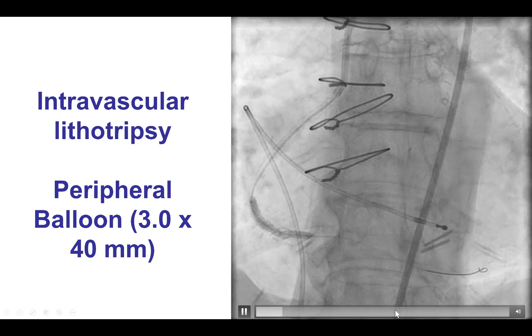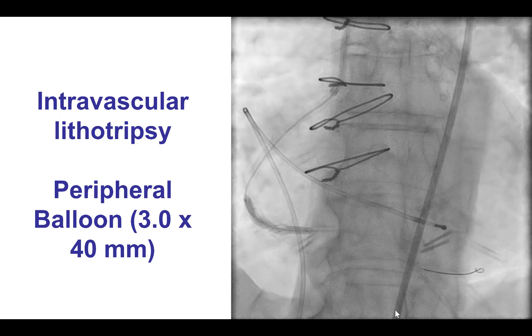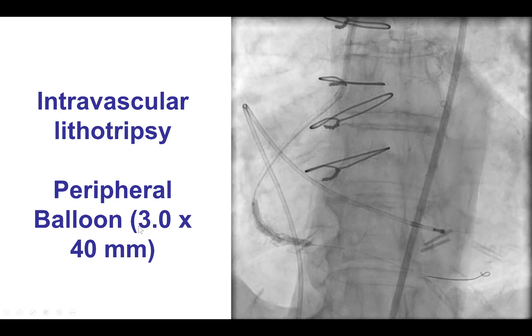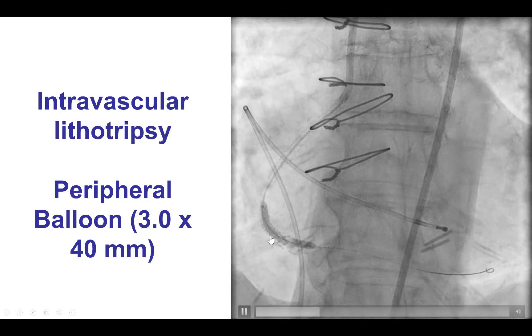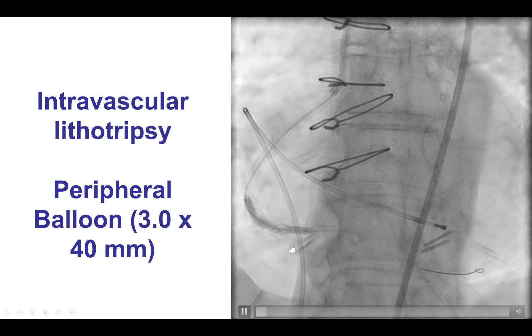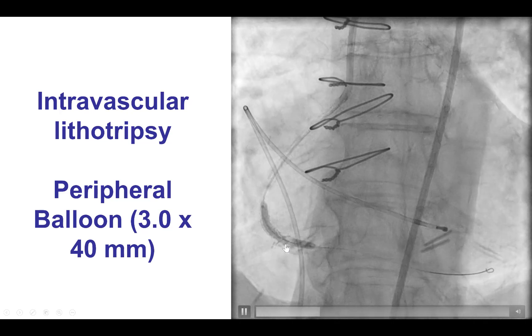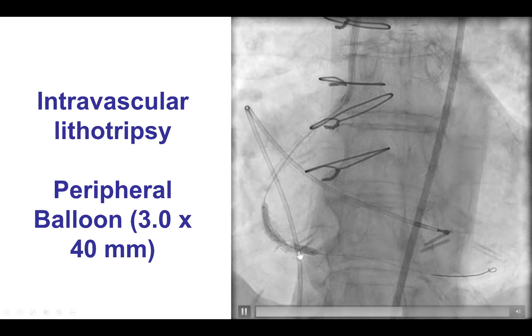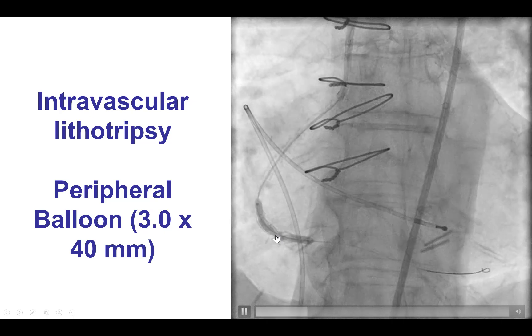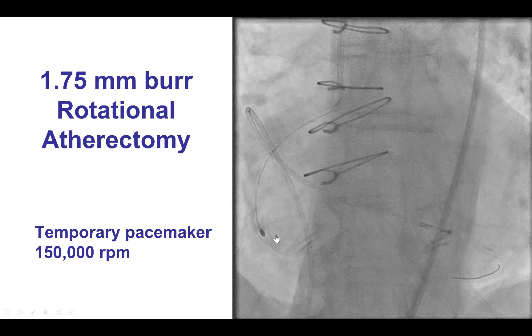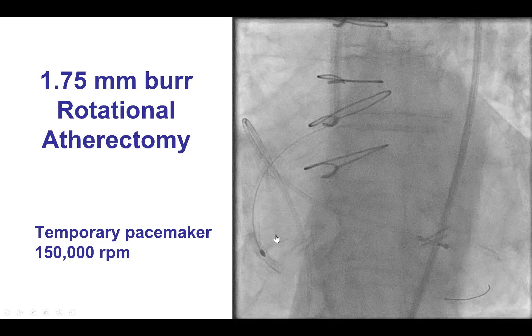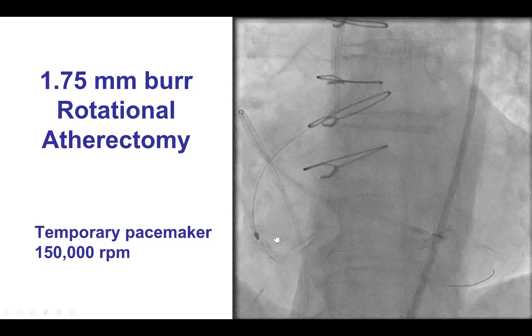We decided to use intravascular lithotripsy. This is the peripheral balloon 3.0 by 40 mm, which was inserted distally and inflated at four atmospheres. We gave the full 200 pulses of the balloon. Unfortunately, that did not work either — there remained a waist, and after post-dilation, the same problem persisted.